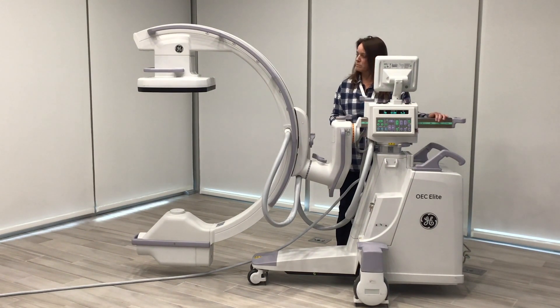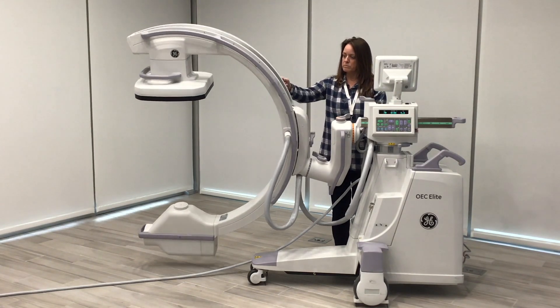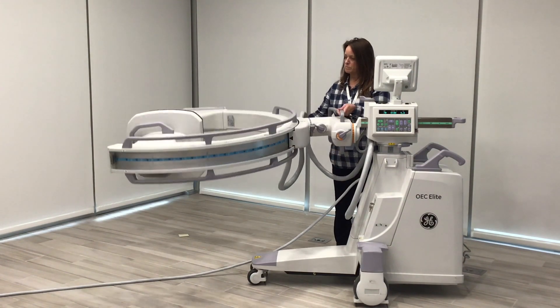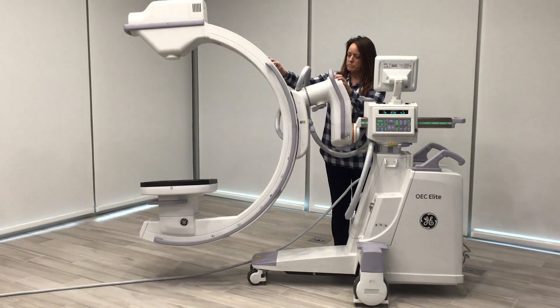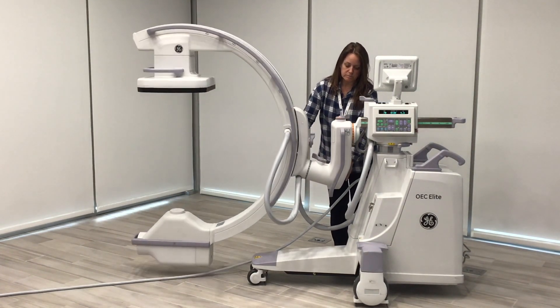From there we move to our cranial caudal brake. Unlocking it allows you to turn the system completely upside down in either direction. You can turn it so the detector is on the bottom and the x-ray tube is on the top, and do this either direction and come back to an AP.